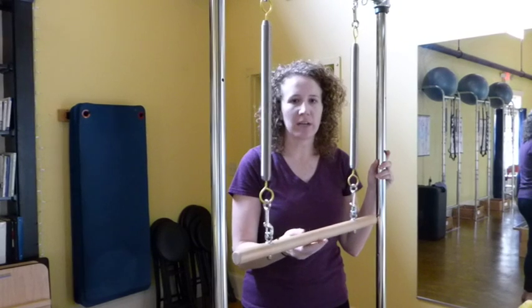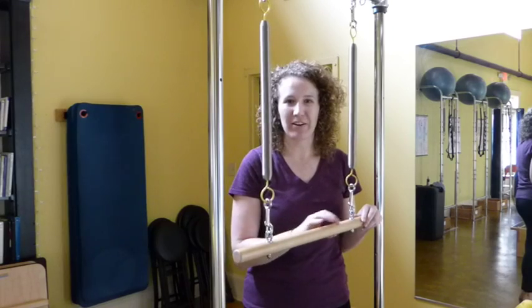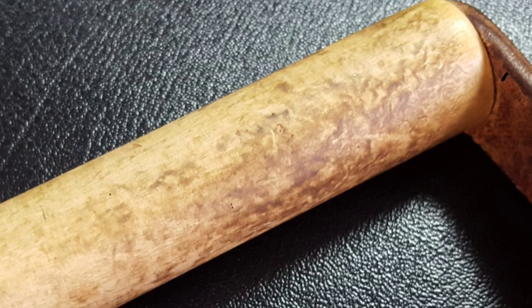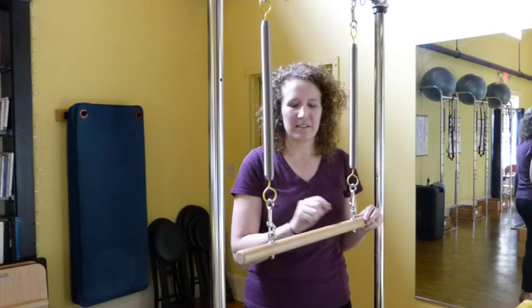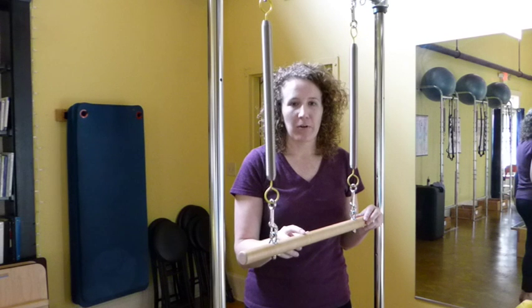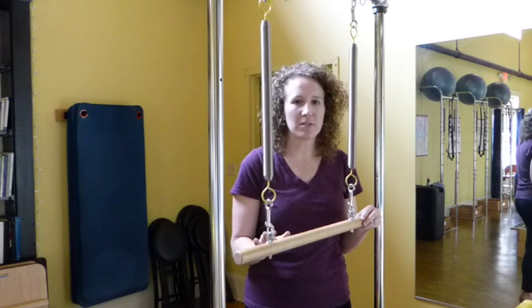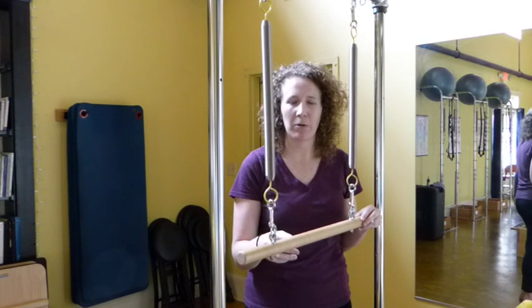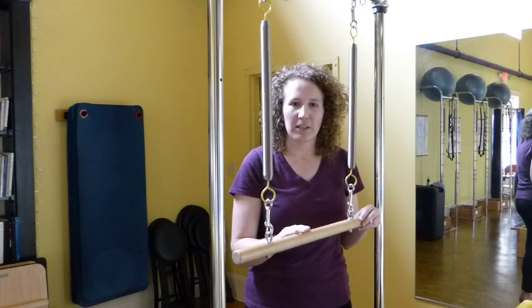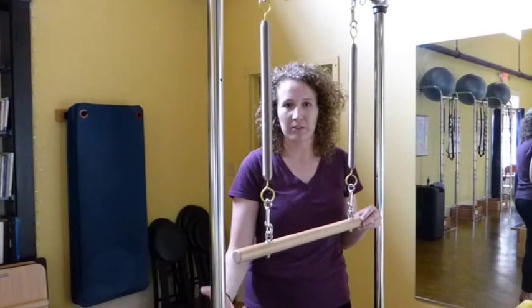If you notice that your roll down bar or any other wooden bar that you use in your studio has a thick layer of grime on it, maybe from lotions, dirt, oils getting stuck on it, you can take some steel wool, the 0000 rating, the very finest, and gently scrub that grime off. You want to be careful not to press too hard, okay? Just have some patience, because if you press too hard, then you run the risk of actually damaging the finish on the dowel. So just rub hard enough, gently, long enough, so that you get the layer of grime off the roll down bar or any other dowel that you have.